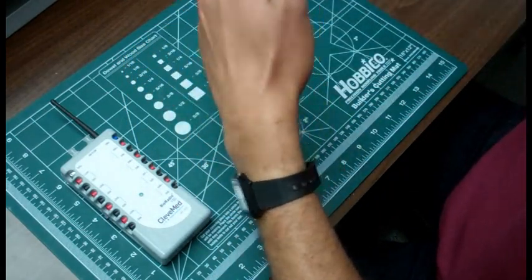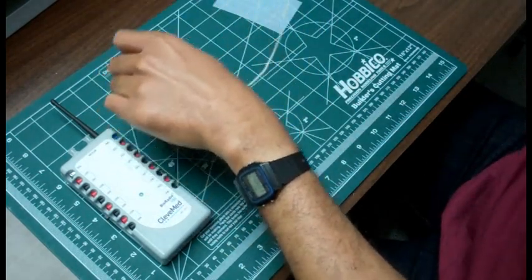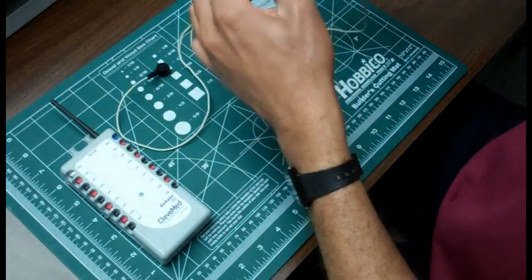We will connect an electrode cable to each electrode on the wrist. We will connect the third electrode cable to the third electrode on the elbow.